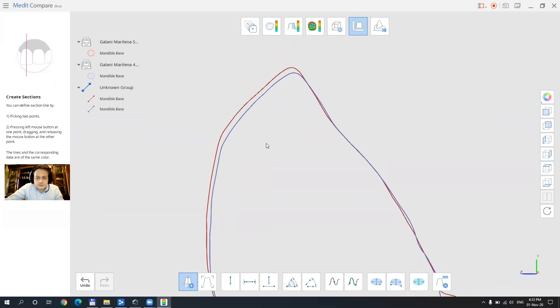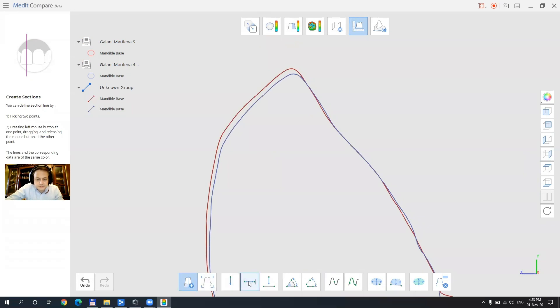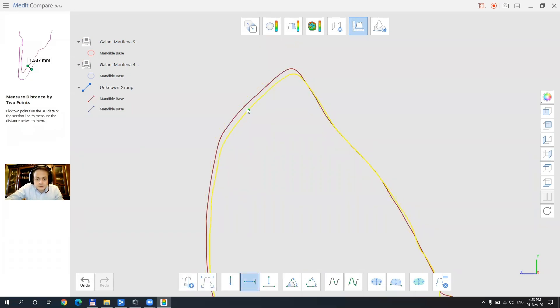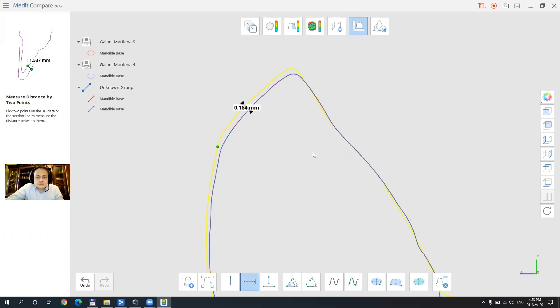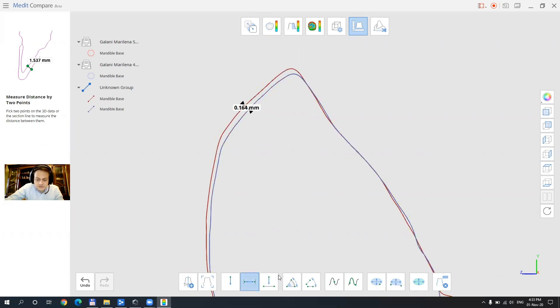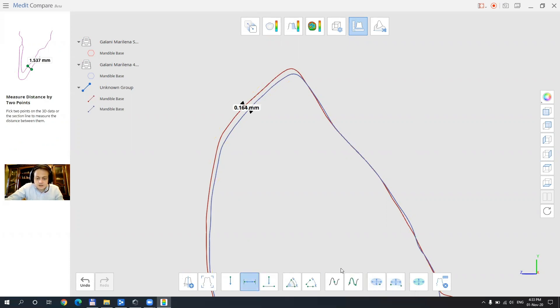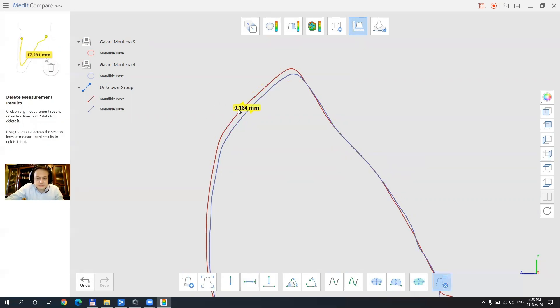we can measure what happened here. Let's see. So the model got modified by around 160 microns. We have various tools here for measurement of angles of surfaces and also we can delete all the measurements using the last tool in the lower right.